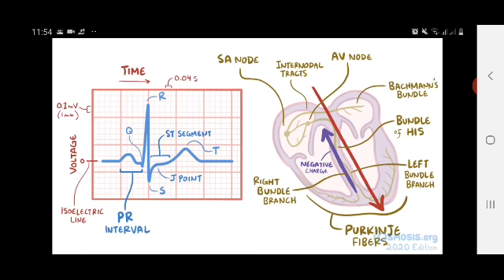The T wave is more spread out over time than the QRS complex because repolarization is a slower process that takes place at slightly different times for each cardiomyocyte instead of happening all at once like depolarization. It's also worth mentioning that atrial repolarization doesn't usually show up at all on an ECG because the small vectors created by it get lost in much larger vectors that get created by the QRS complex.